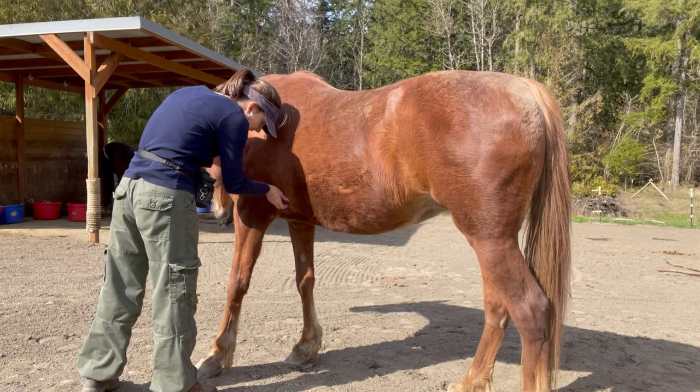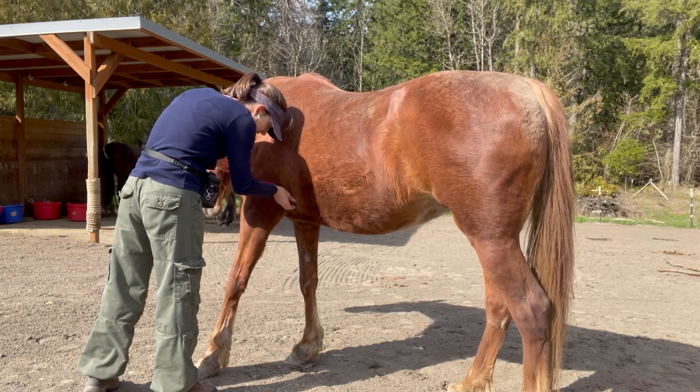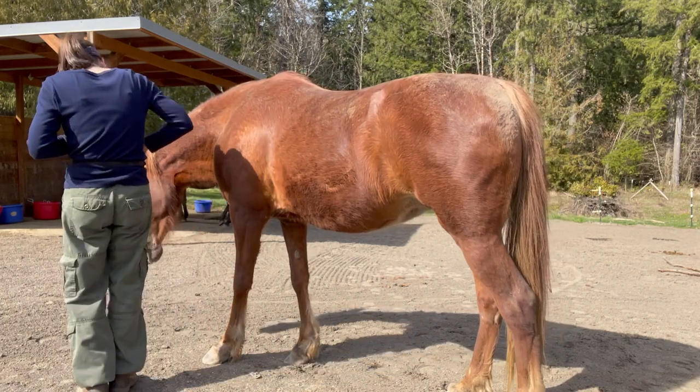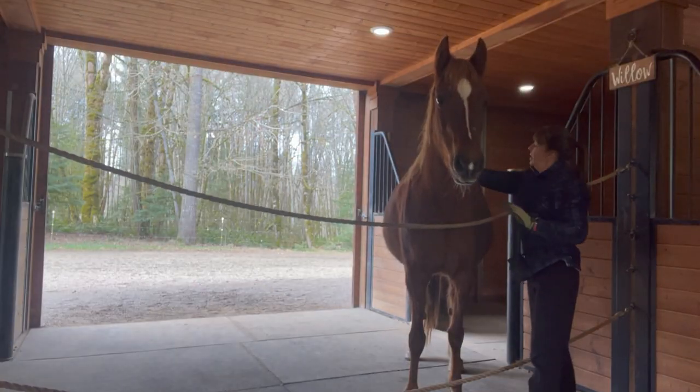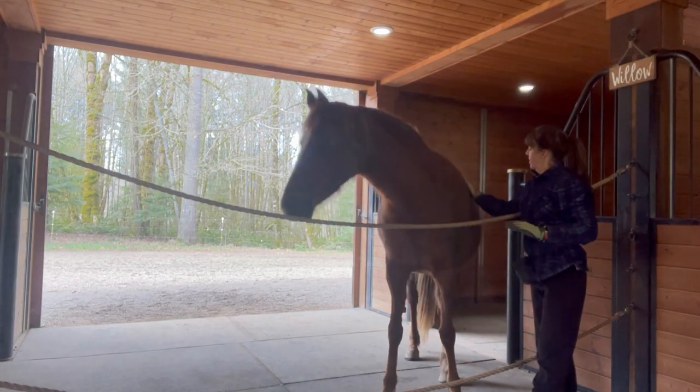When you call your vet you want to give them all of the horse's vital signs, including their pulse. To get the pulse, we place the stethoscope right behind their left elbow on their side. But first, we need to prepare our horse for the stethoscope.